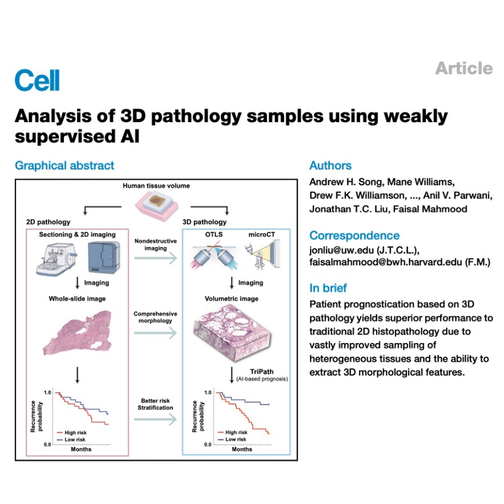But here's the really striking comparison, the standard clinical benchmark. After surgery, pathologists examine the entire removed prostate to assign a Gleason grade. That's the gold standard for risk assessment post-op. Right. The definitive grade. TriPath 3D, analyzing only the initial tiny biopsy core, achieved an AUC of 0.860. The post-operative Gleason grade from the whole prostate had an AUC of 0.761.